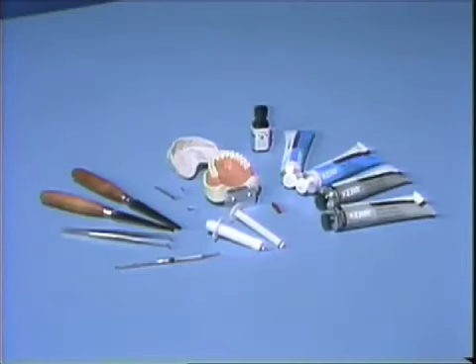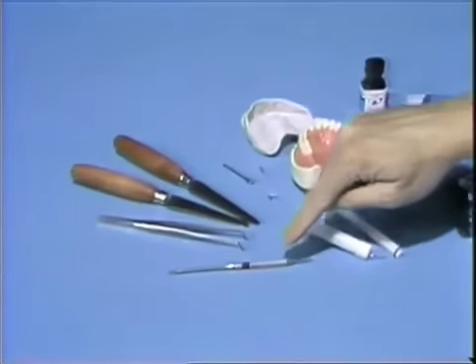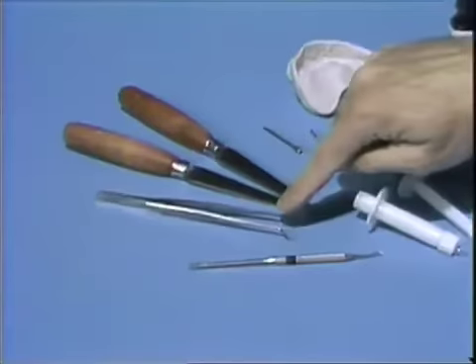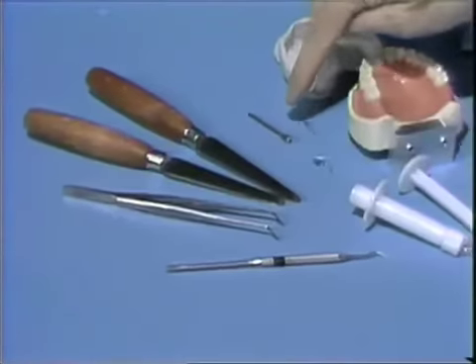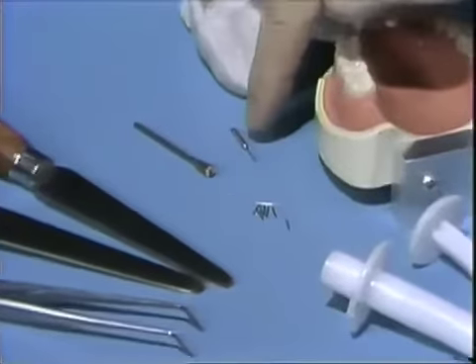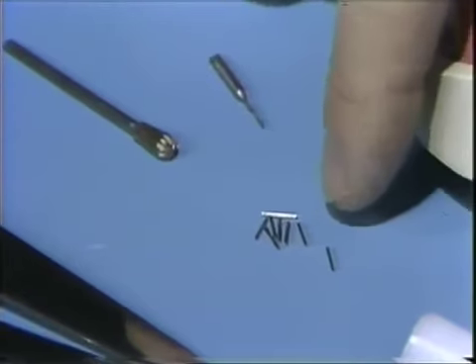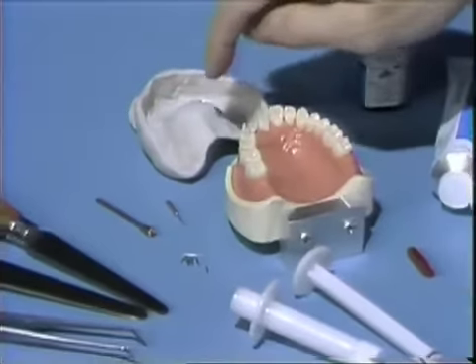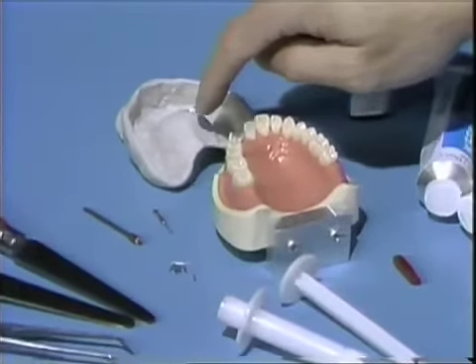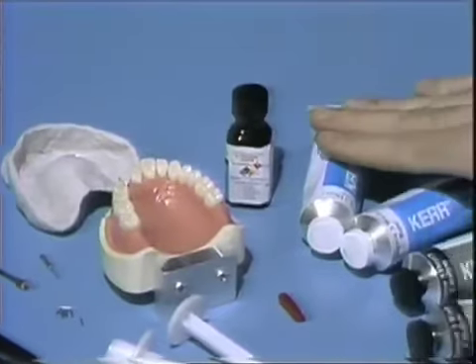Assembled before us are the items we're going to need this morning to take an impression of this porcelain fused to metal and pin ledge preparation. In the front we have a periodontal probe, some type of locking forcep or hemostat, our mixing spatulas, probably an acrylic burr, a 3-0 twist drill, and metal impression pins. Our typodon, the special tray we've already made the night before, our adhesive, and our polysiloxane impression material.